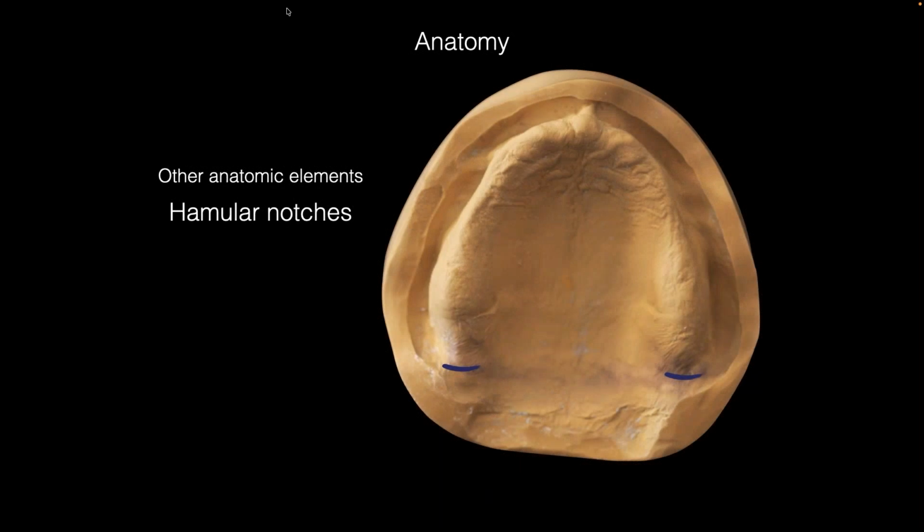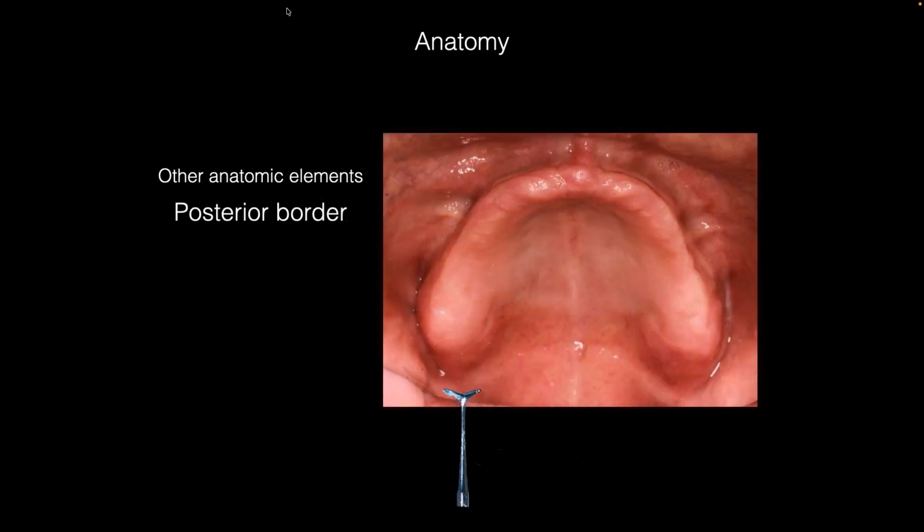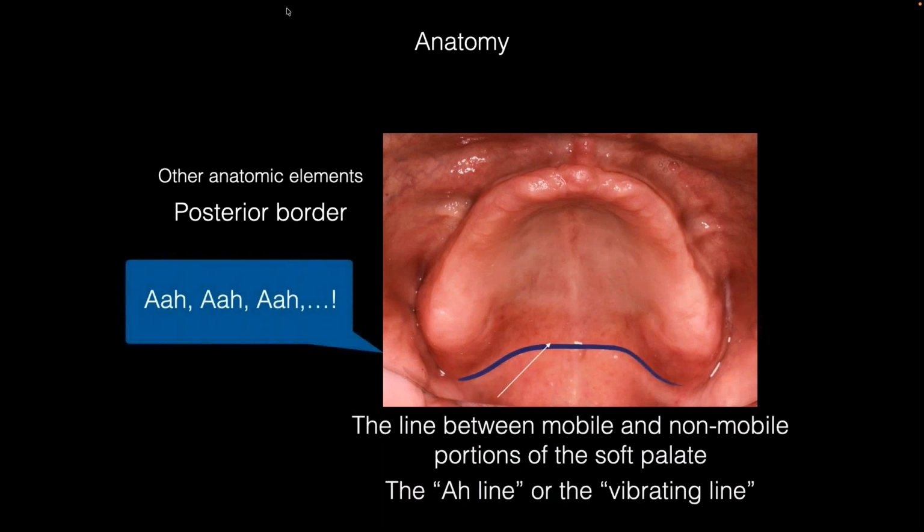There it is, you can see it. And how do you identify it in the mouth? You're gonna need a T-burnisher. It's easy. Get a T-burnisher, go posterior to the tuberosity, keep going posterior until you fall into the notch. And then very easily just mark it with an indelible pencil, and then it gets transferred to the master model.